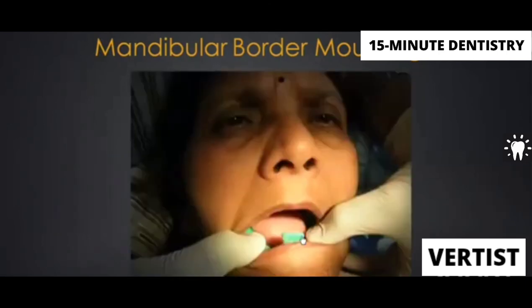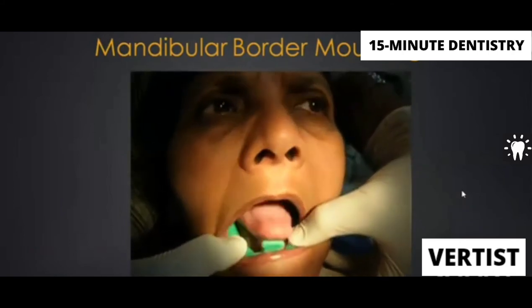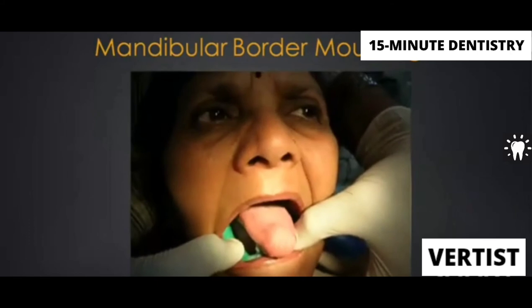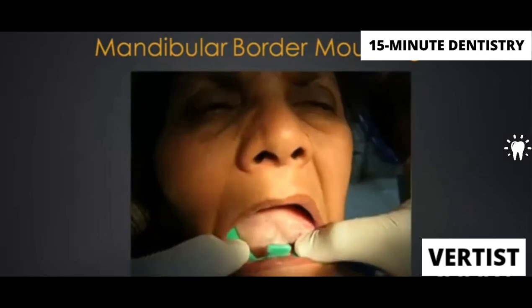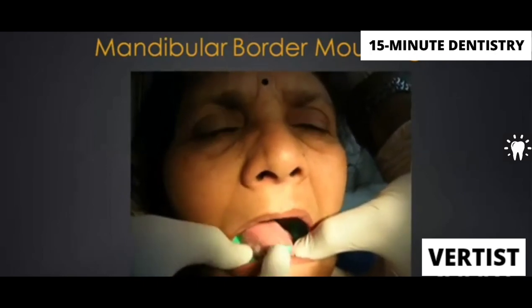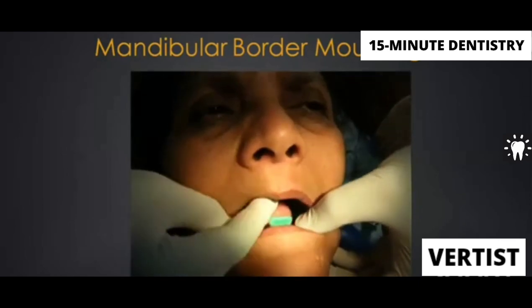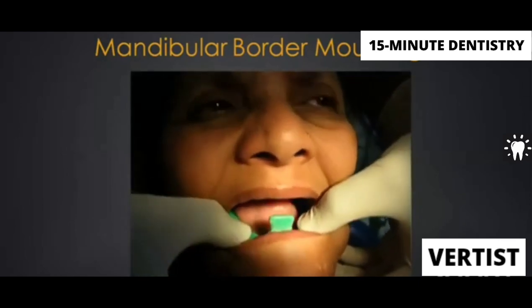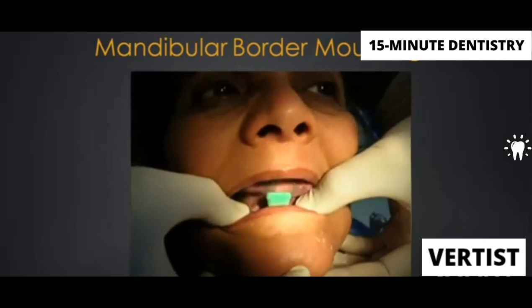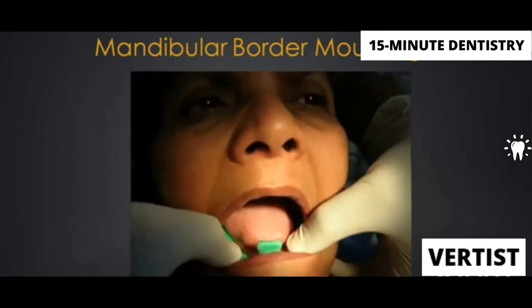Once your lingual is done, I'll show you the tongue movements if the video plays. The videos are not playing clearly today. Ask the patient to protrude the tongue. Right, left, cheek. The anterior part of the tray, just the handle, maybe the upper lip, and the posterior part of the palate. Each movement will mold a part of the border molding material, which you just read in the books.